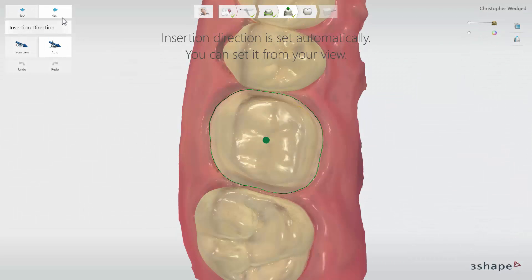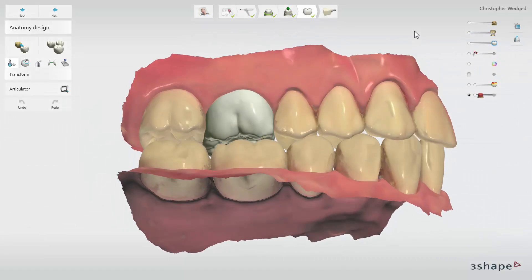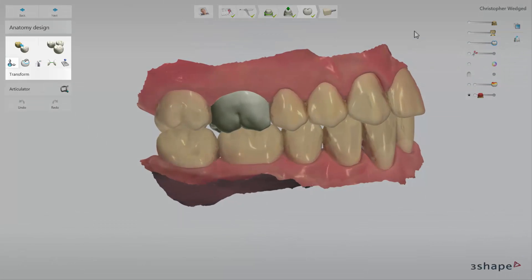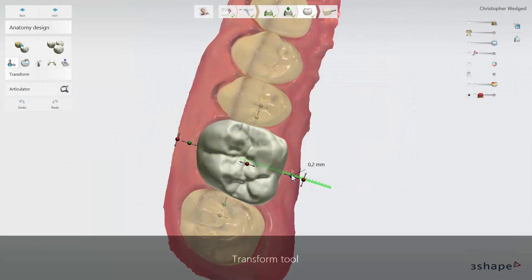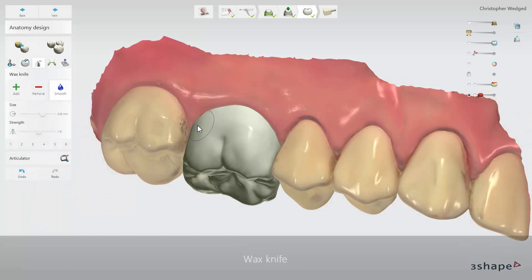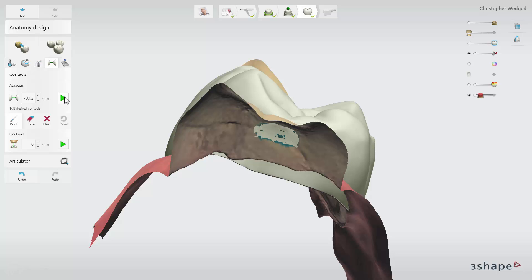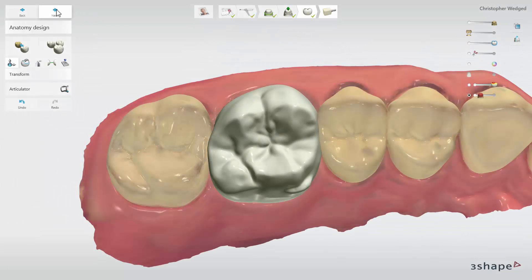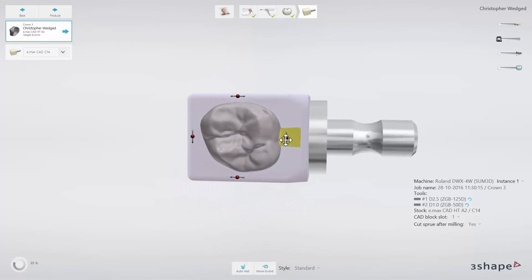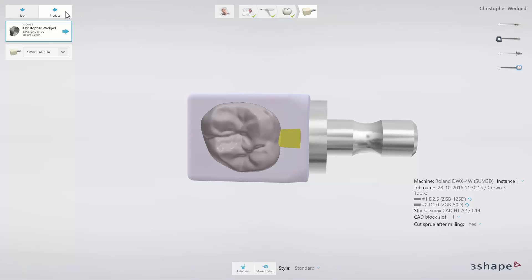The next step is Insertion Direction, which is automatically detected and has an optimal suggestion. Then go to the Anatomy Design step, where automatic placement creates a valid design. You can perform some adjustments using the design tools. If placement is satisfactory, click on Produce to have the CAM file sent over to the milling machine.